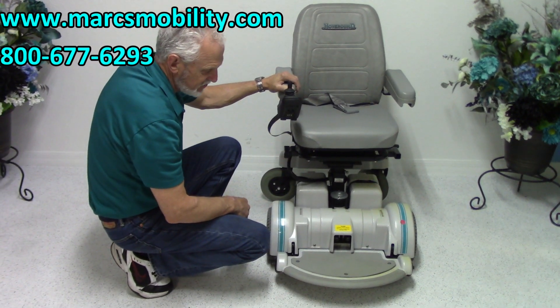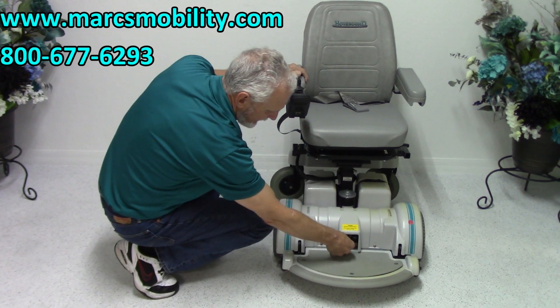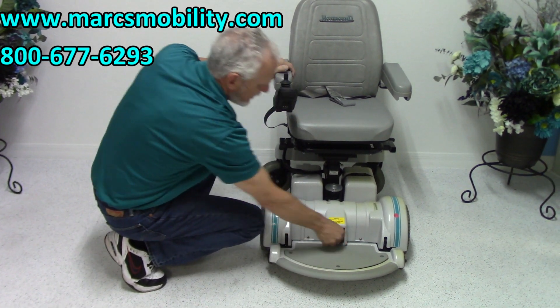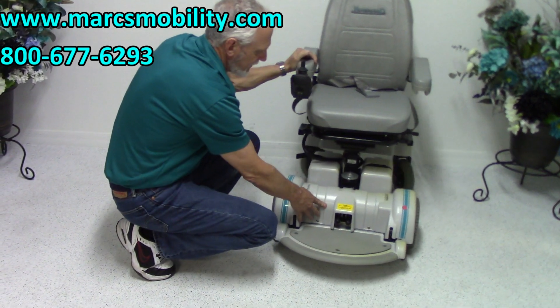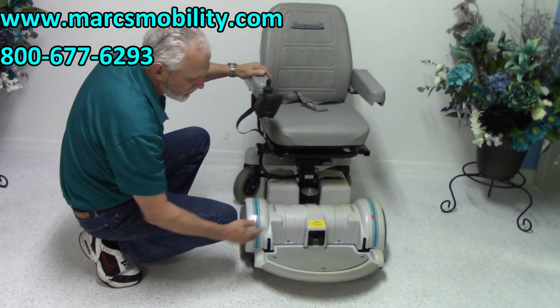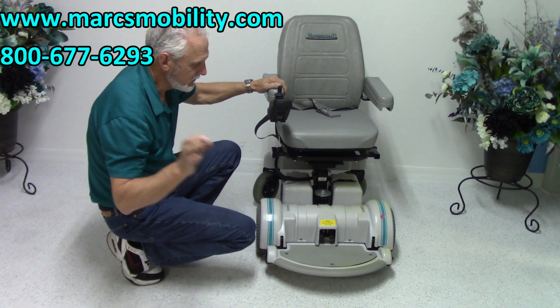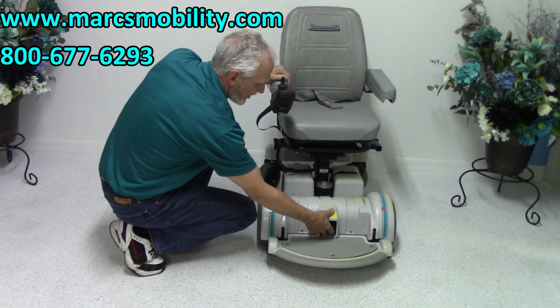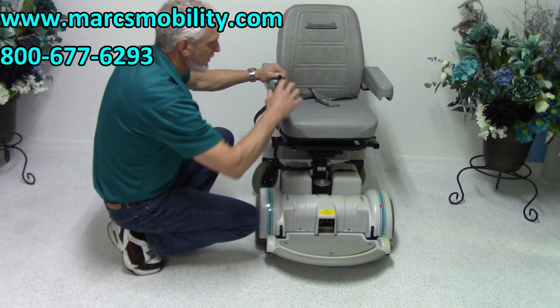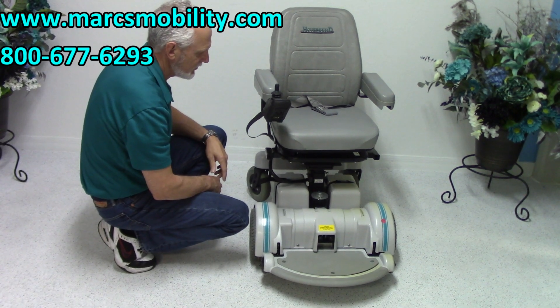If I wanted to push this chair right now, I couldn't because it's in gear. The motors each have a lever right here — one, two — and now I'm in neutral. To put this chair in neutral is right here, but do not forget to put it back in gear. If you don't put it back in gear, you'll be calling me. Back in gear, turn the power on, and you're back in business.